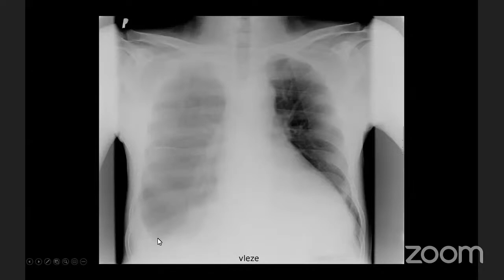And again, you see the crescent sign, because the fluidothorax is around the lung, it usually gives the impression that there is much more fluid in this area. There is a silhouette sign of the diaphragm because there is no difference between diaphragm and lung, because the lung is not reaching the diaphragm, as there is fluid in between.